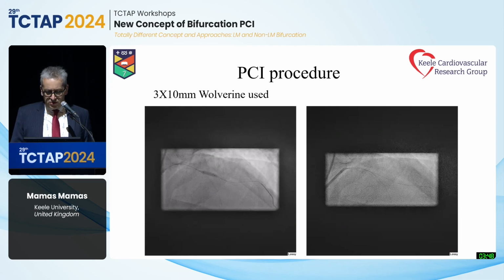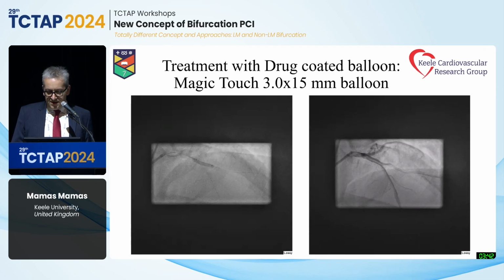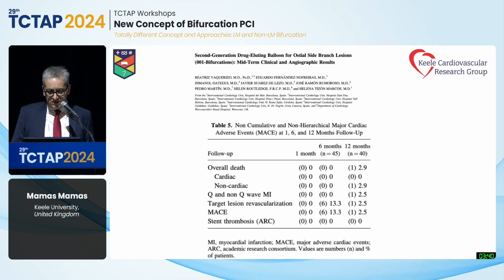I used a cutting balloon, good result with the cutting balloon. I used a Magic Touch with an excellent final result. And really, I think nowadays a lot of people are increasingly using drug-coated balloons. And this is some data. It's a small registry of only 45 patients.